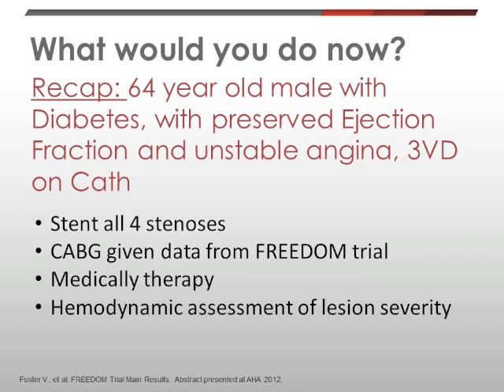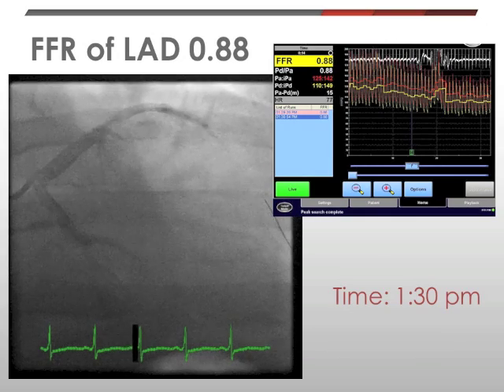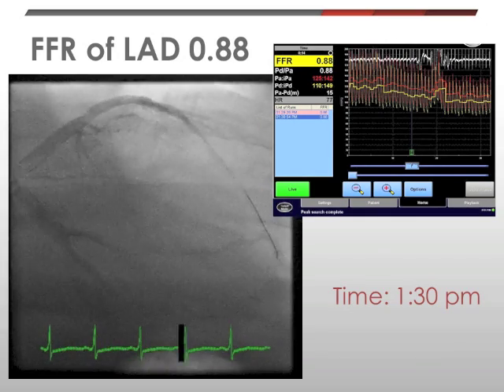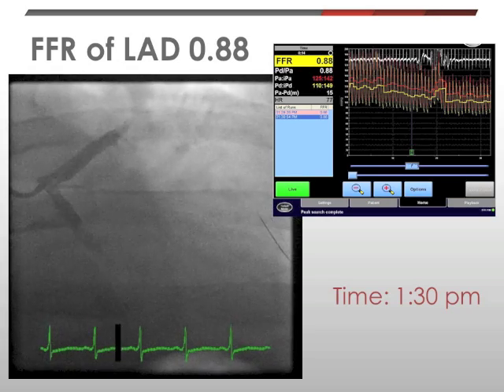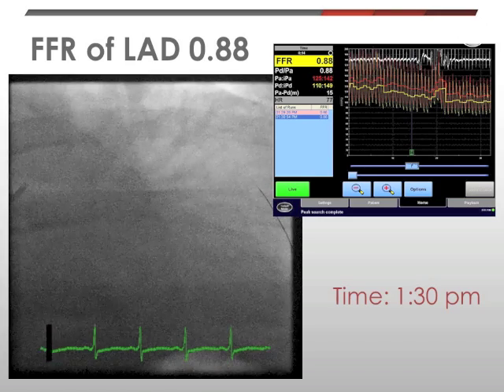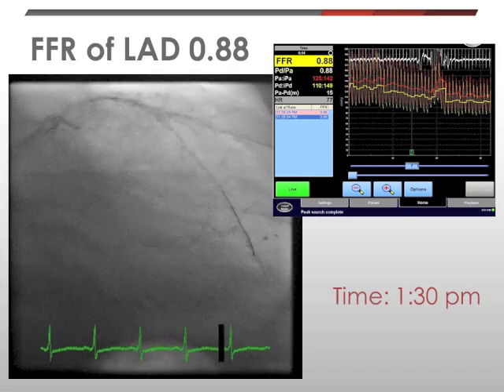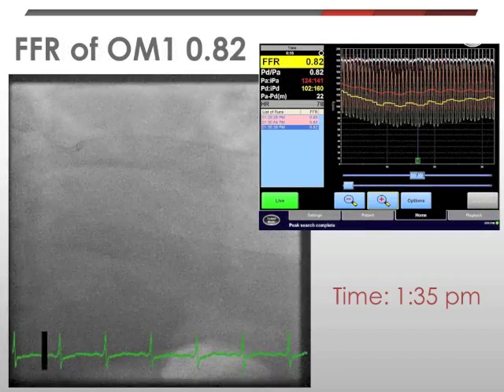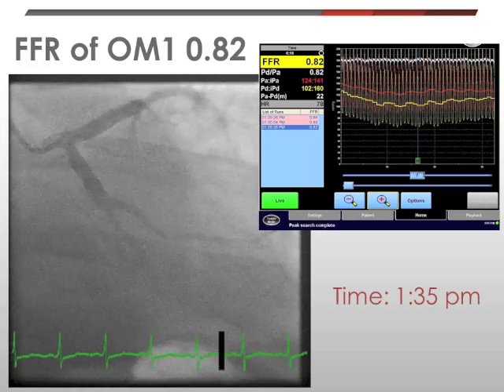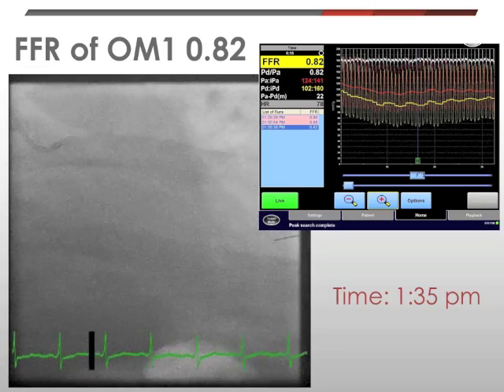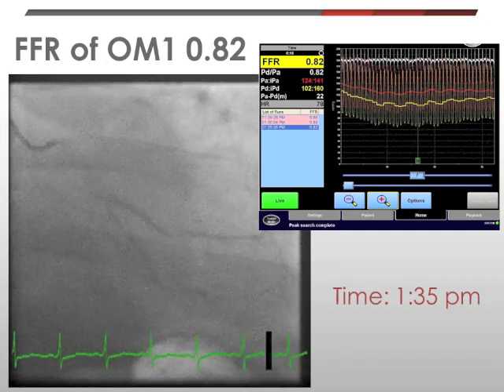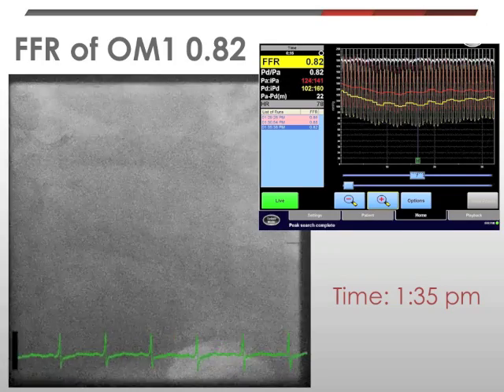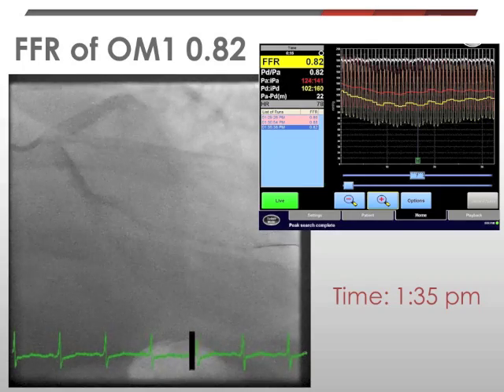We decided to proceed with hemodynamic evaluation of all of these lesions — so multi-vessel FFR — and note the time at which we started the procedure: 1:30 p.m. The first vessel evaluated was the LAD, which demonstrated a non-significant FFR of 0.88. Next, the wire was withdrawn for a pullback and re-equalized at the tip of the guide, then advanced into OM1. The FFR of OM1 was 0.82, which is also consistent with a non-ischemia-producing stenosis. Note the time — this is five minutes later, so it can be done relatively quickly.